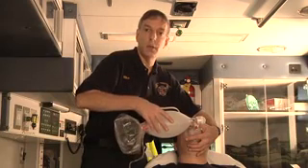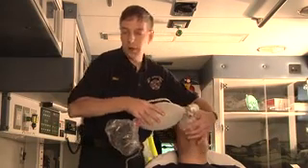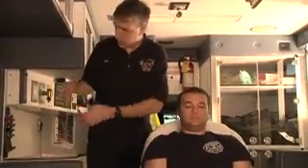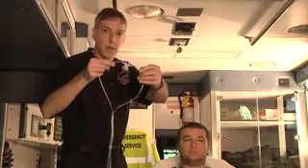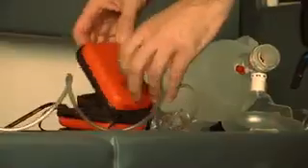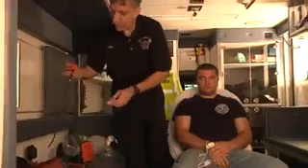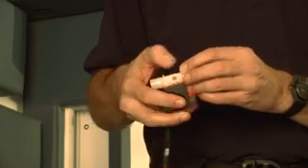We talked in another episode about using capnography, and the capnography can be used through a nasal device that actually sits over the patient's face and measures the exhaled carbon dioxide. Or at the basic life support level, there's now a portable capnography device that can be attached between the bag valve mask and the patient to give you an exhaled carbon dioxide value.